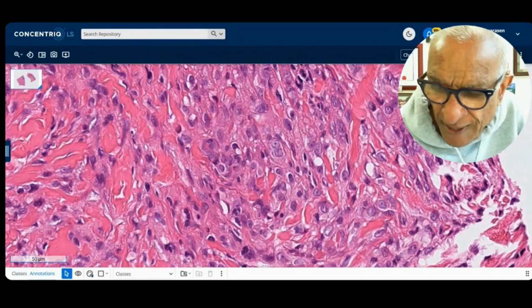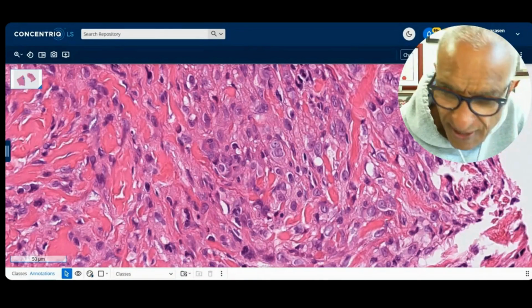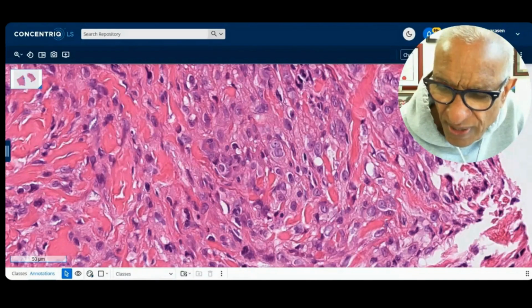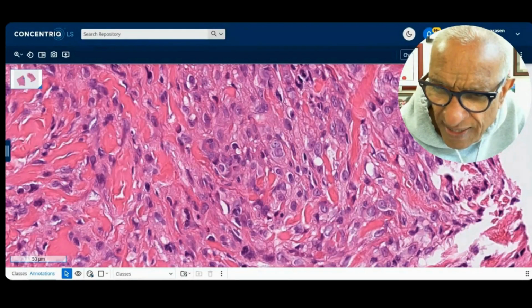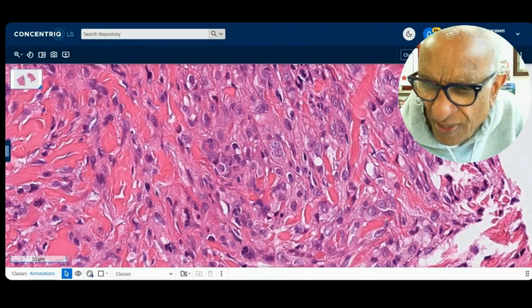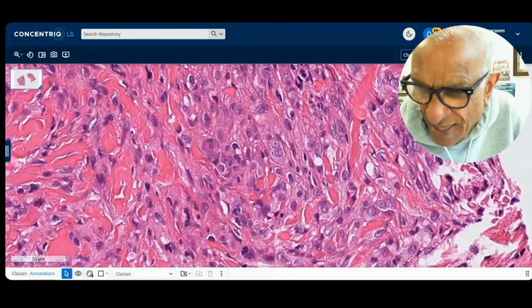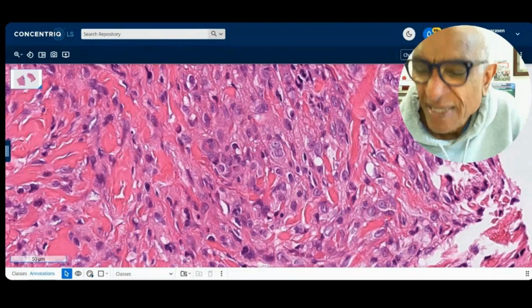So thinking about that, CD34 and desmin stains will help you in that. And then, of course, RB1, which is lost, the retinoblastoma gene. Remember, that's also lost in things like spindle cell lipoma as well as cellular angiofibroma. So that's a good thought. The other stain I like to do for mammary type myofibroblastoma is an ER, and I find that useful. Albert Tool also asked the question: Are these cells rhabdoid? That's a very good observation. Let's hold that and let's see.